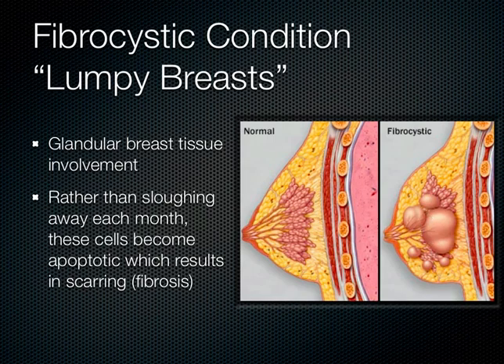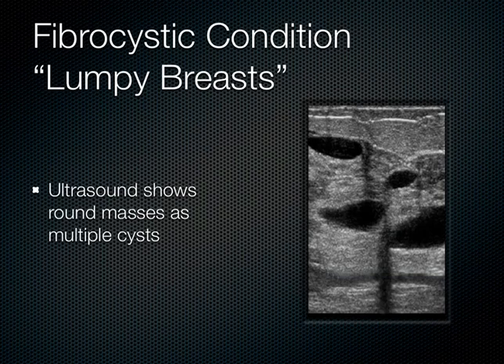And on ultrasound, this is what it looks like, just multiple cysts everywhere. And you can notice on the edges of these cysts there's these shadows that come down. And there's another one here. And basically that's something called refraction artifact. The sound is going through the skin and then into this glandular tissue here, and it reaches this cystic structure, and then the sound is redirected.